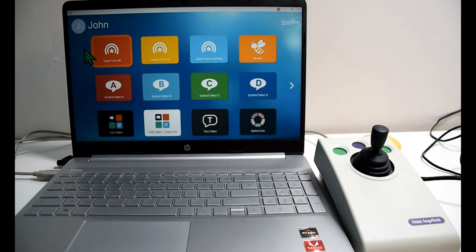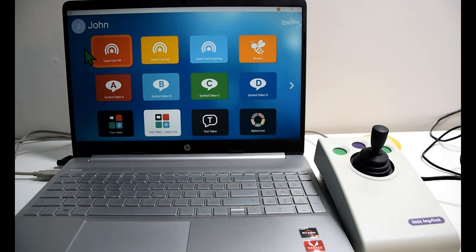Okay, welcome back. Now I'm going to talk about switch scanning and how the Jazz can be simply used for switch scanning with Grid 3 or any other AAC software and device.